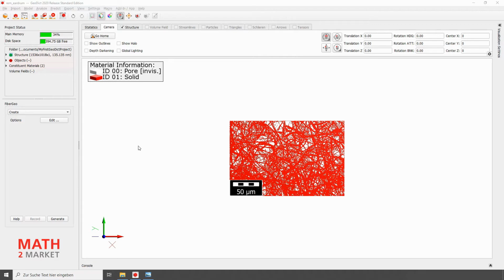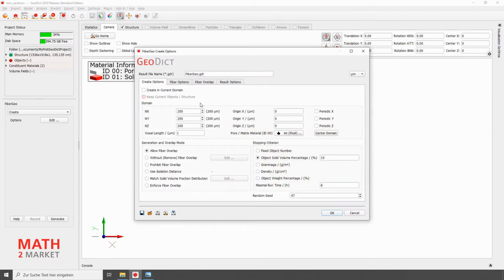To create a model of the eardrum, we select the module FiberGeo in the menu under the tab Model and click on the Edit button to set the parameters for the fiber generator. First, we define the size of the domain we want to model. For our example, we choose 1000 by 1000 by 100 voxels.